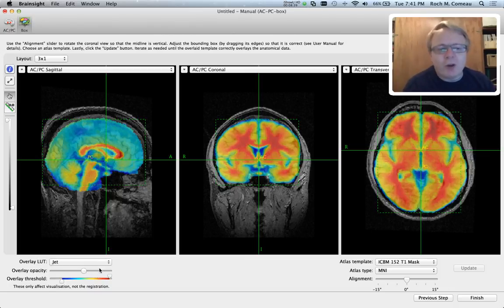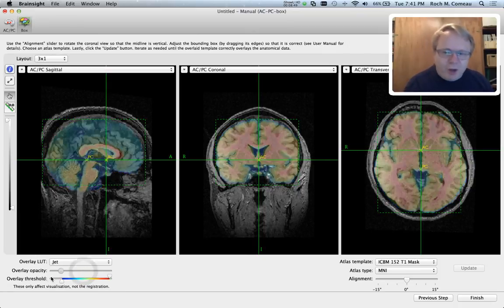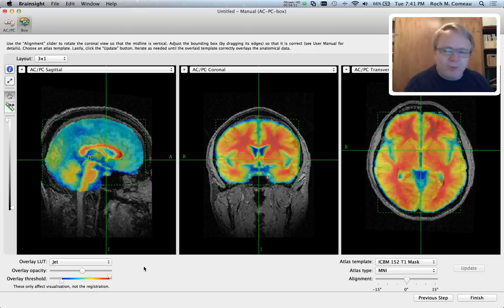We require that the brain remain in the original shape since we're trying to co-register this MRI head to the subject's head. So we've done the opposite. We warp the MNI head to fit the subject's head. Mathematically, it's the same thing. We can go back and forth.